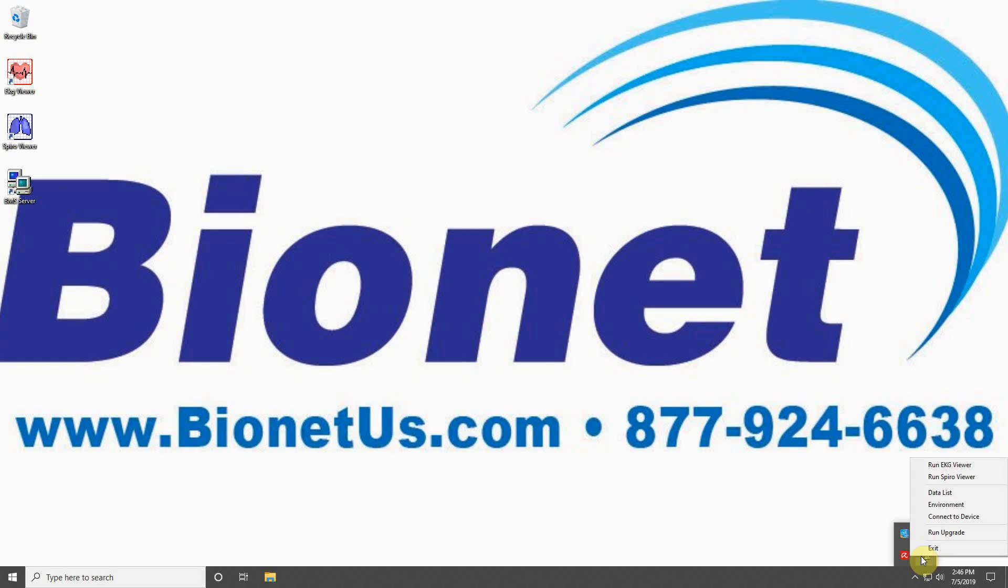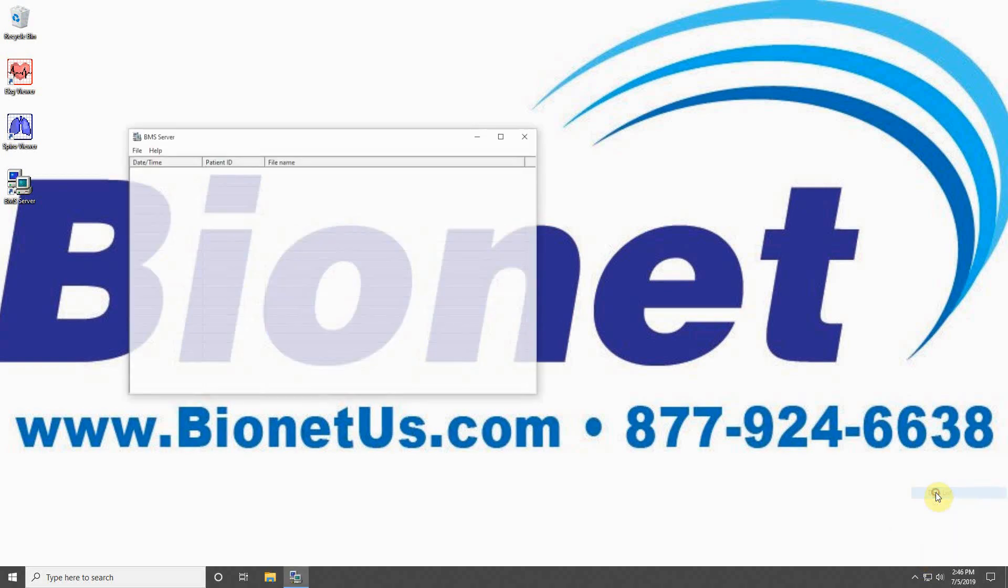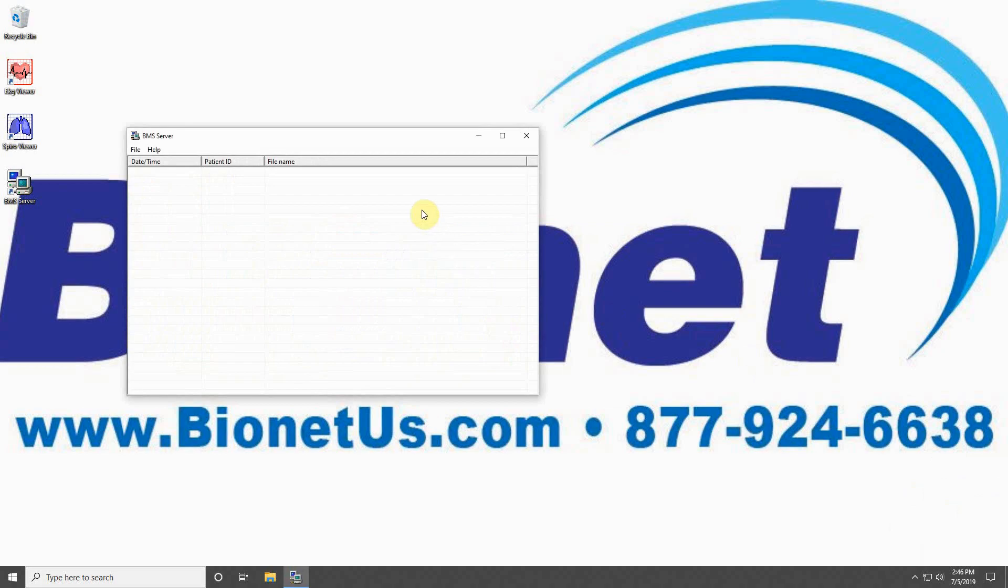Above Environment is the Data List, which is where you can access a list of all transferred data on your computer, found in the folder location you chose under Working Directory.